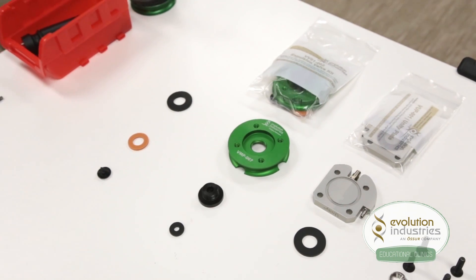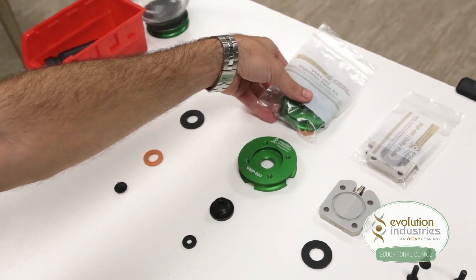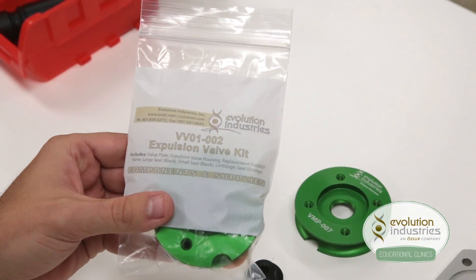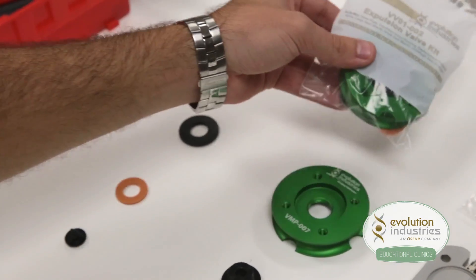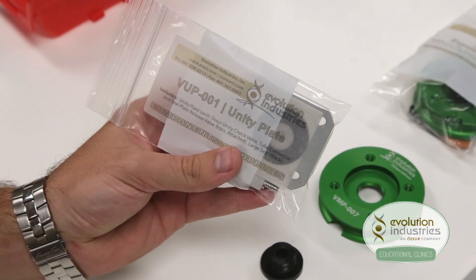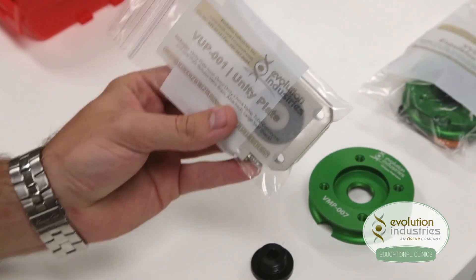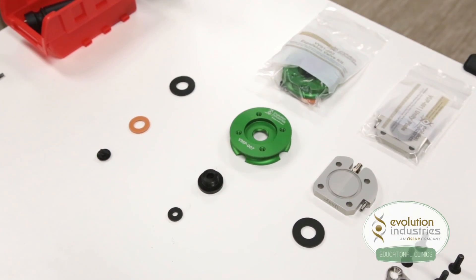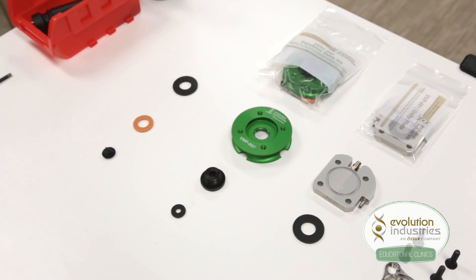To set up your Unity system, you will need an expulsion valve kit, part number VB01-002, and the Unity Plate, part number VUP-001. You can also buy both of these kits in a combo pack, part number CB05.